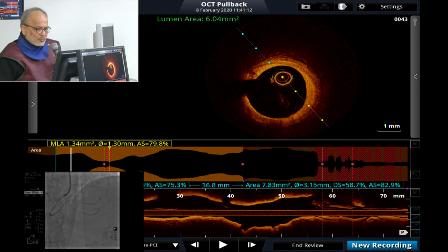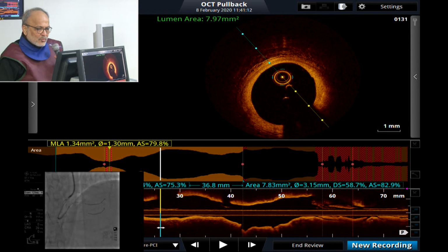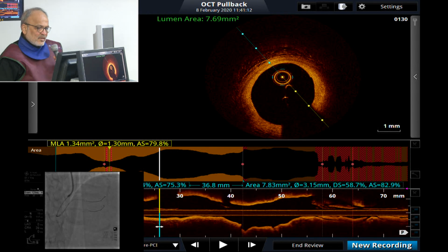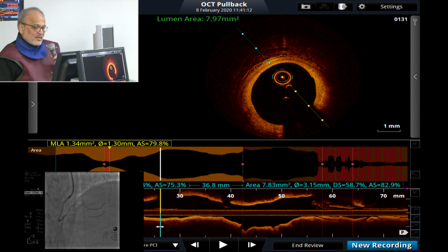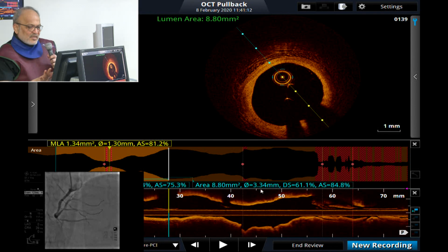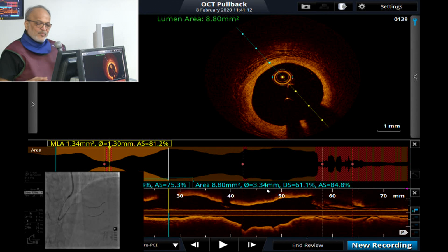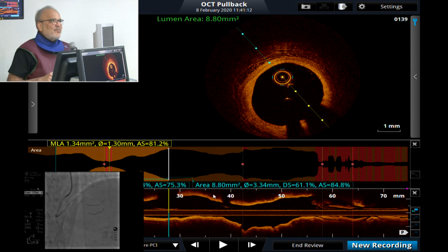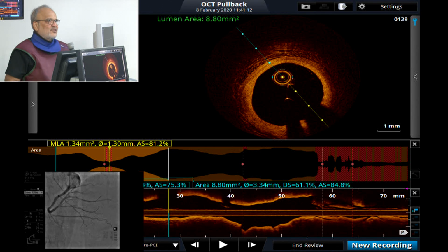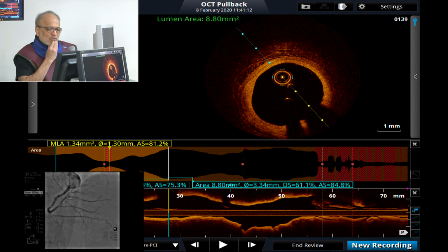2.75 is also okay. Probably 3.0 here, 3.0 or 2.75 we can take. The proximal is... just a moment. 3.3. This is a good area. Proximal is 3.34. Wow. I think 3.0 can be a good trade-off. So 3.0 to 3.5, right? Yeah, that's right, 3.0 distal and 3.5 proximal. And 22.2 is the length. So maybe 20.